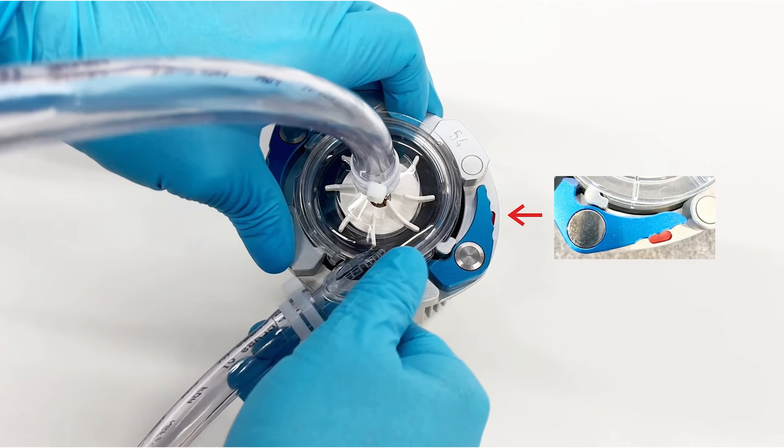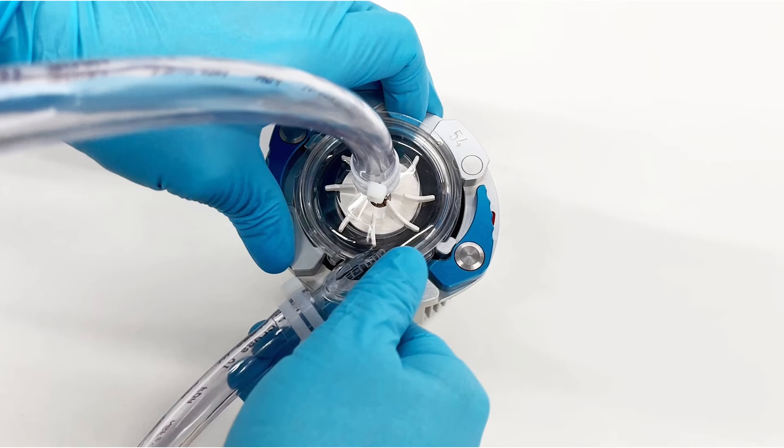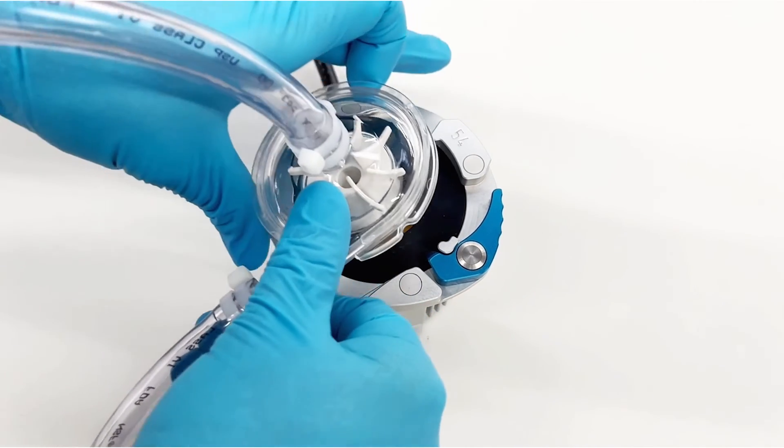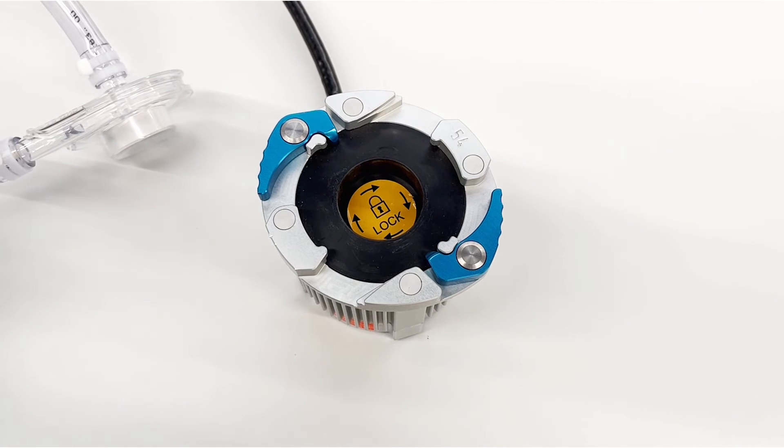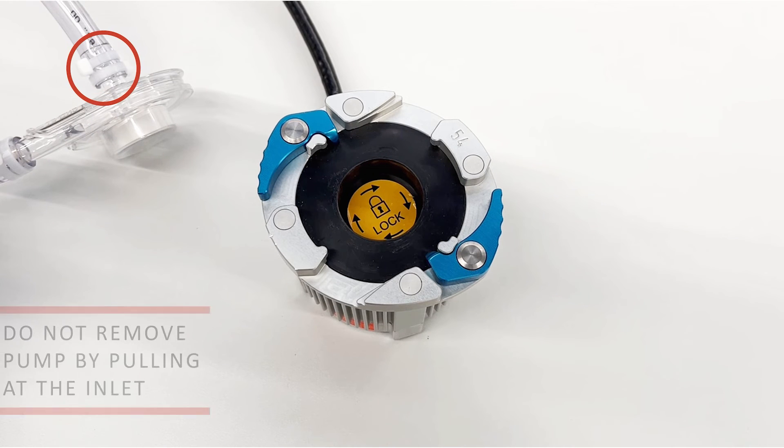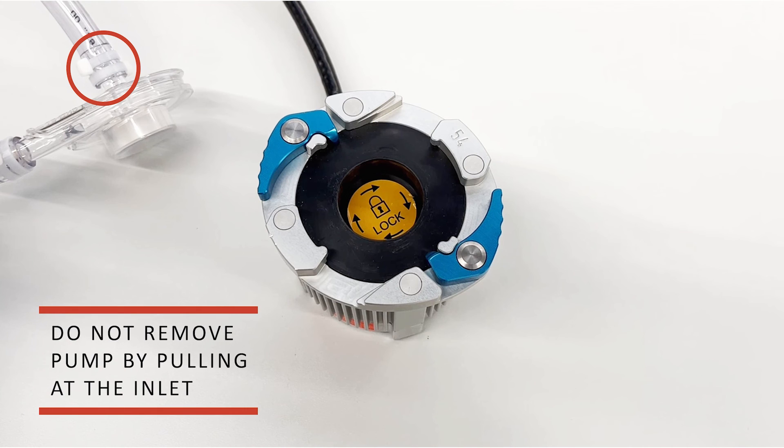A visible red mark will indicate that the pump is no longer locked into the motor. Remove the pump from the motor by grasping the body with one or two hands and lifting straight up and away from the motor. Note: pulling from the pump inlet is not recommended.